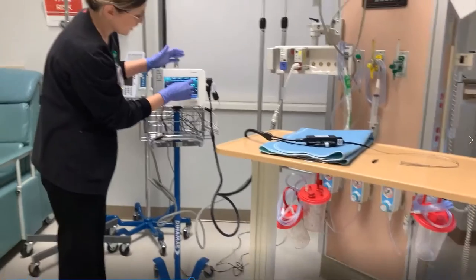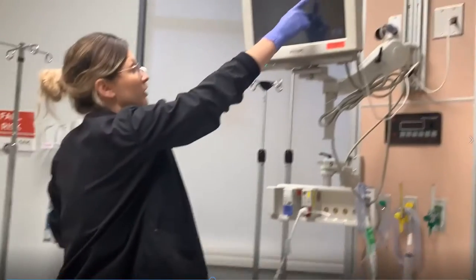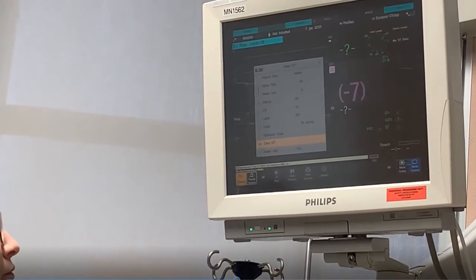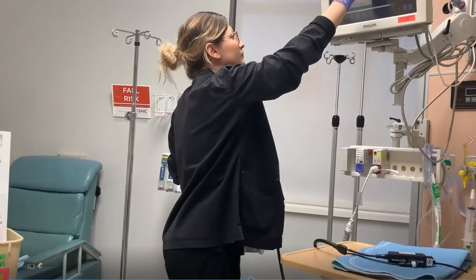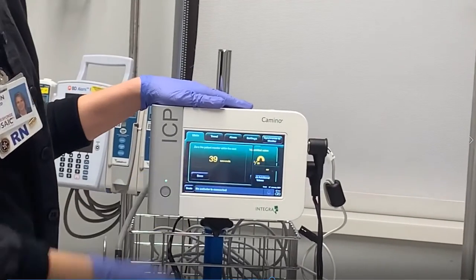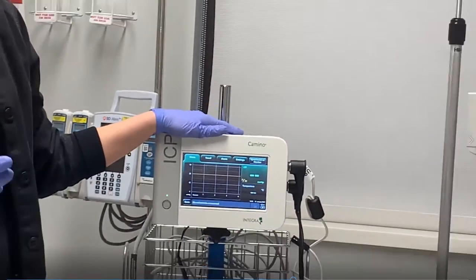You're going to hit the synchronized monitor button, which gives you 60 seconds to make these two machines talk. In that 60 seconds, come up here and zero the ICP like you would an arterial line. Once you get a zero, hit done — now these two machines should talk and you should be able to pull your ICPs into the charting system.